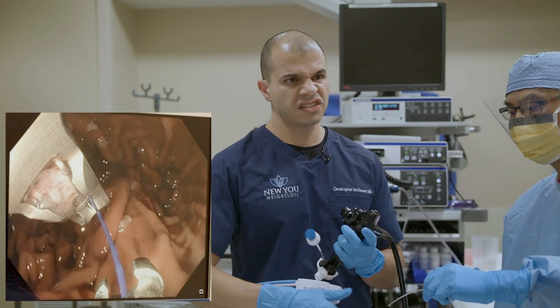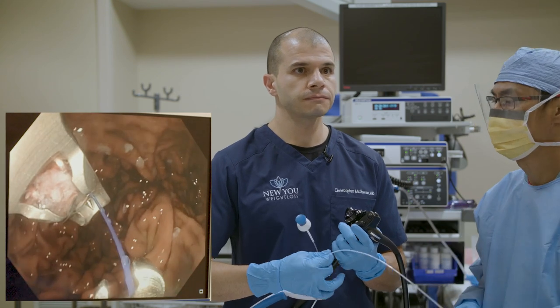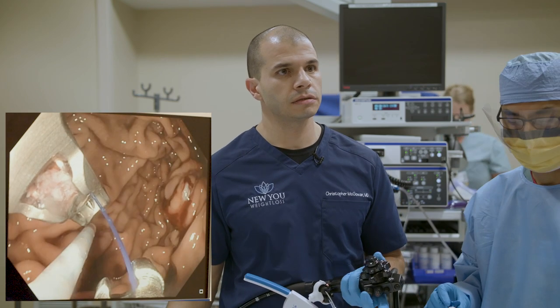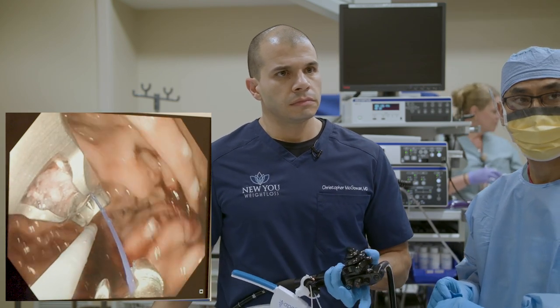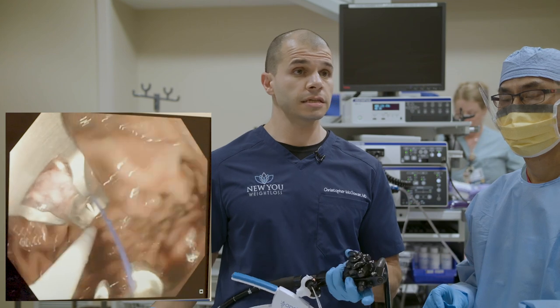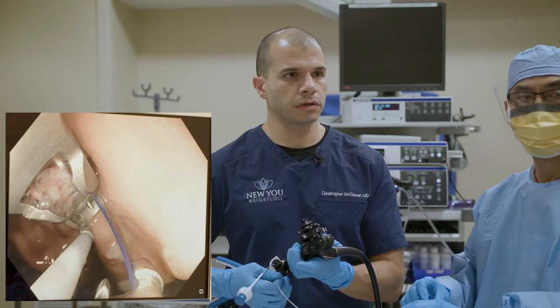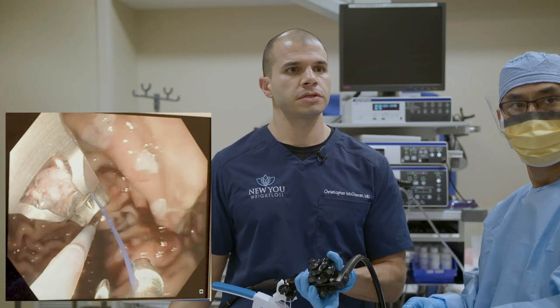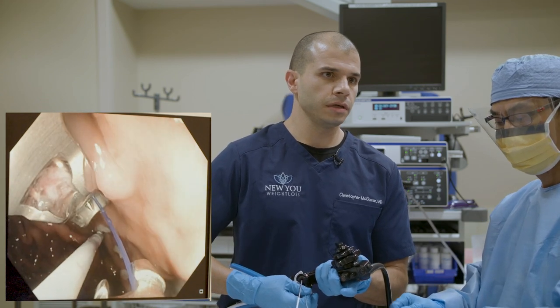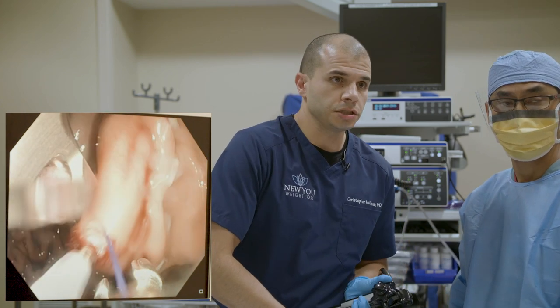Our average number of sutures is six, depending on the size of the stomach — typically somewhere between five and seven. Question from Candace: is ESG possible with a BMI of 26? That's certainly on the lower end. I'd want to explore why we're looking for this procedure at BMI 26 and ensure all other options have been explored. But there's no contraindication based on BMI — it can certainly be done.